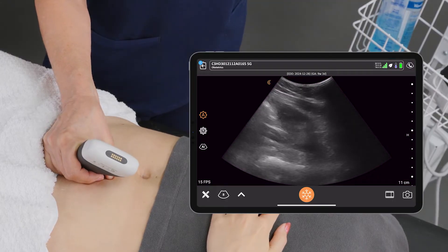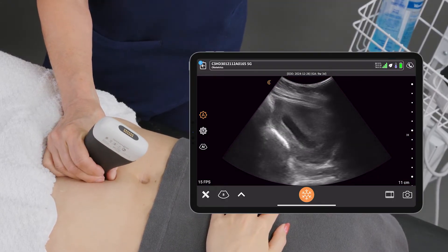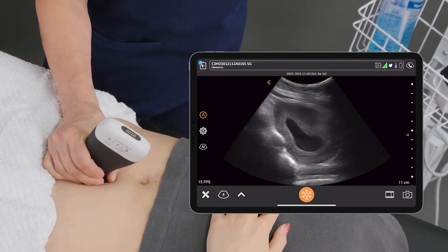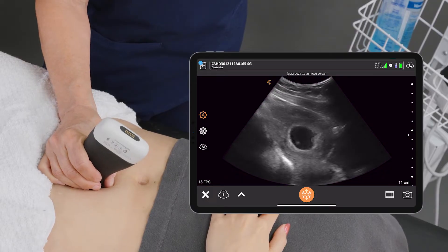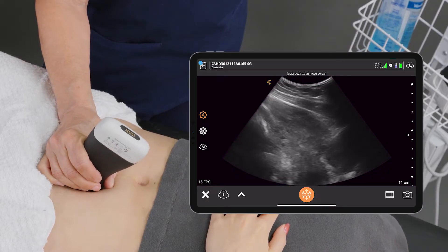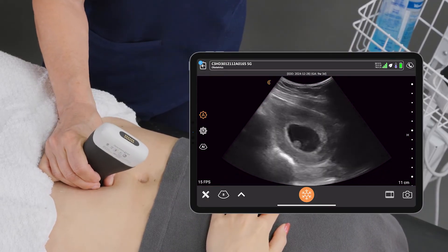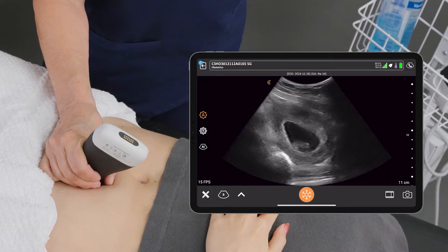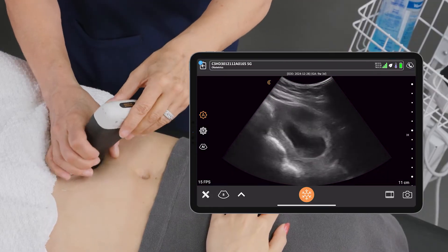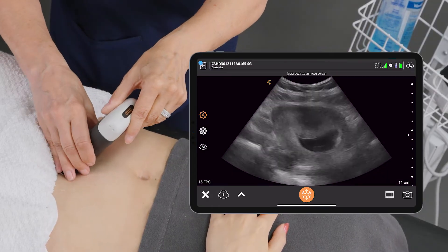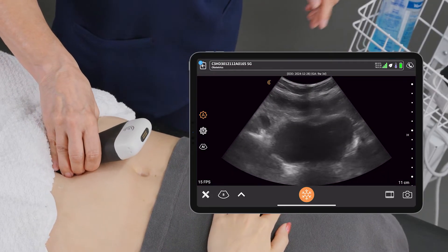We can establish that there is indeed only one pregnancy, one fetus, and then I can turn my scanner 90 degrees and look in the transverse plane as well.